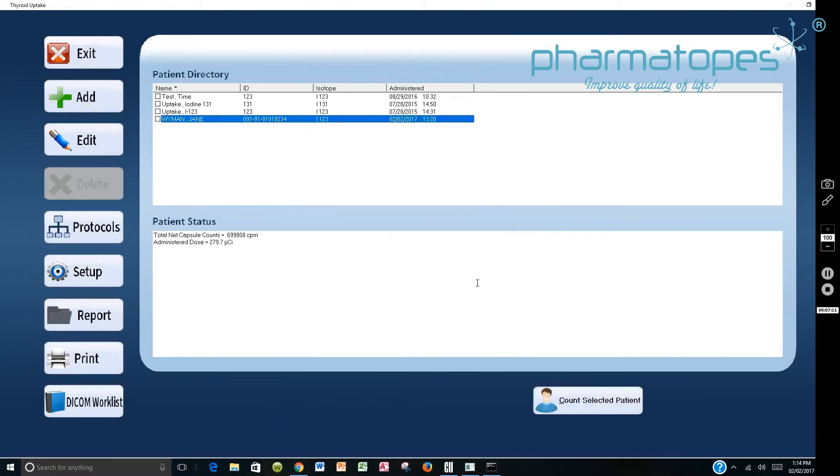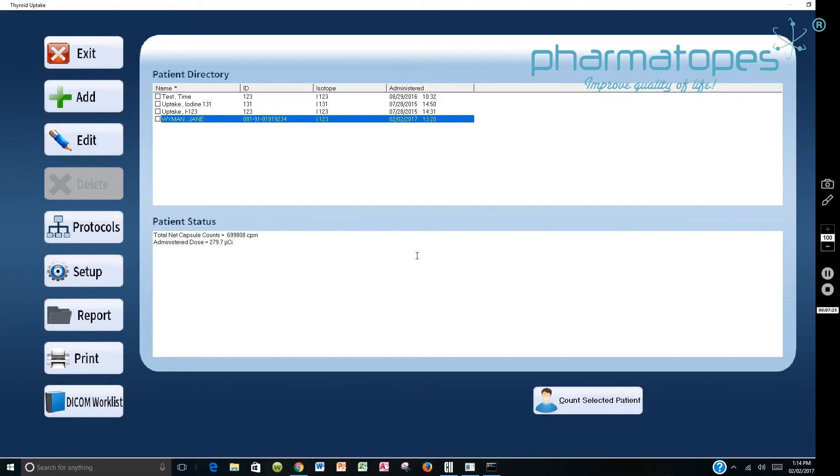So now the information's been entered. The capsule count has occurred. The doses have been administered and the activity has been calculated for the current time. So I can now count the selected patients. So in 24 hours we will count Ms. Wyman and the uptake will be sent into the DICOM server.